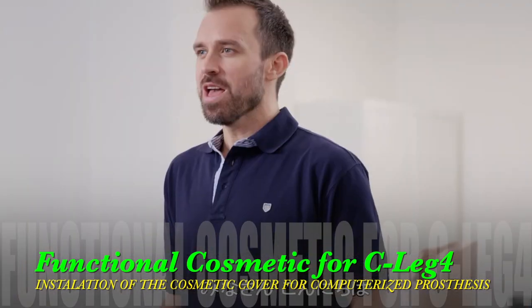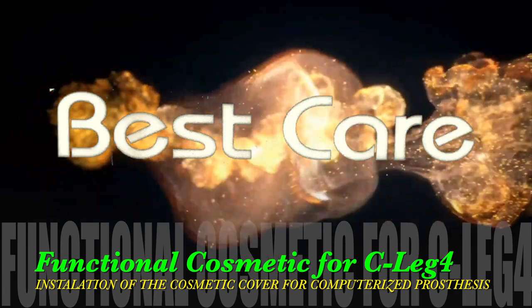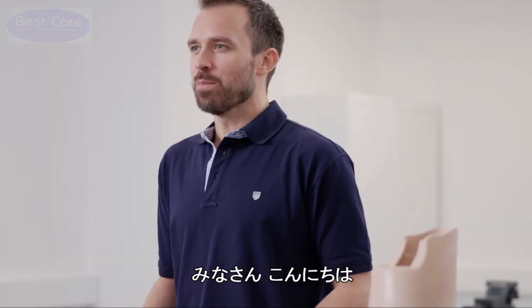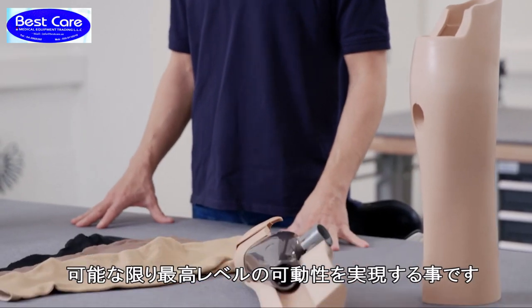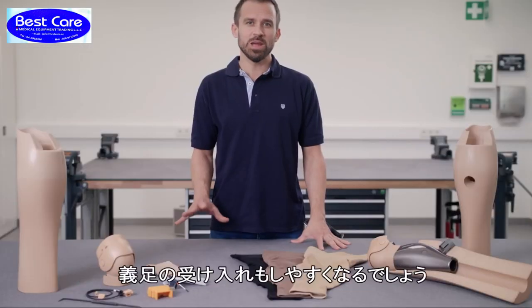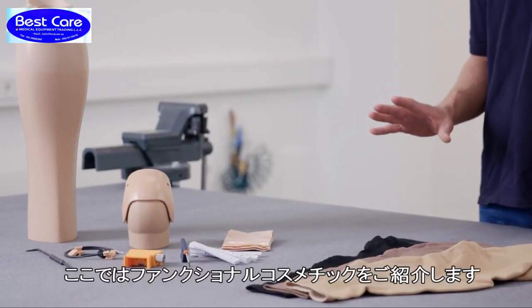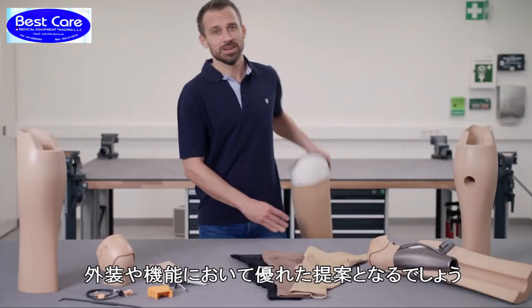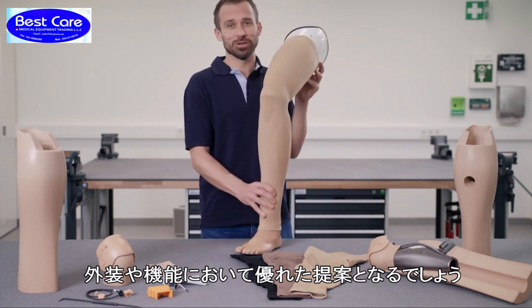Hello, my name is Thomas Hynord. Welcome back to Best Care Rehabilitation Forum. My goal is to have prosthesis wearers look their best in addition to achieving the highest possible level of mobility. They should be able to accept their prosthesis as a fully adequate replacement for their leg. Today I'm going to show you a leg prosthesis with a functional cosmesis which I think is an impressive solution that looks good and is functional as well.